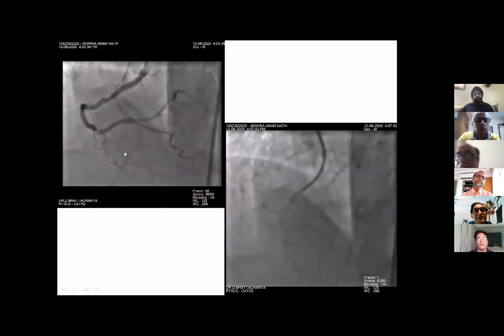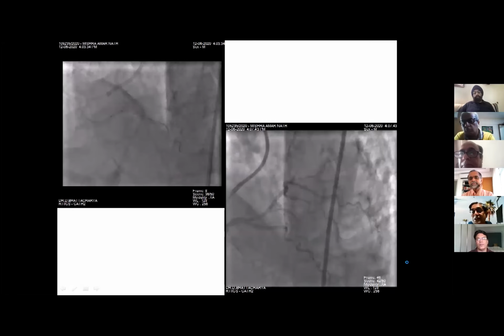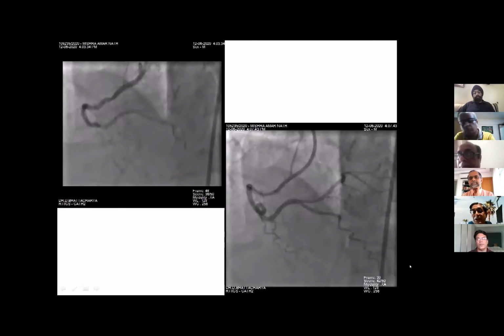As you can see, the PLB looks quite okay. We have stented the PDA and we have stented this, and you can see this appearance here, which I think is a concertina effect due to this wire. It's not a dissection, so I withdrew the wire there and took another picture, and you can see it is not a dissection there. So I decided that the case should end here, and the only thing that was left was to take the catheter out safely.